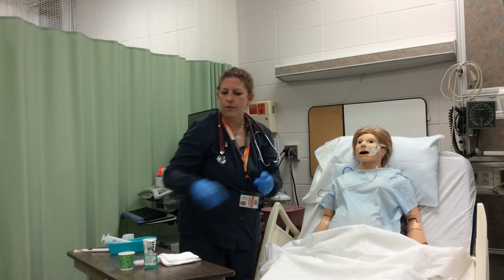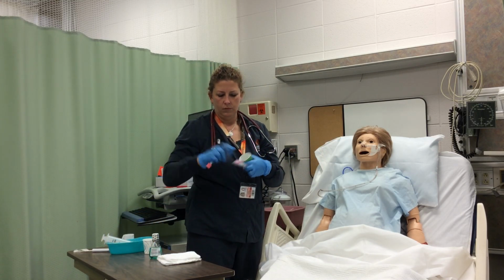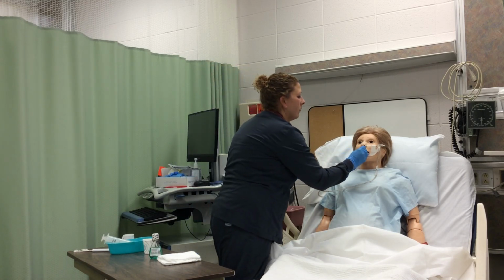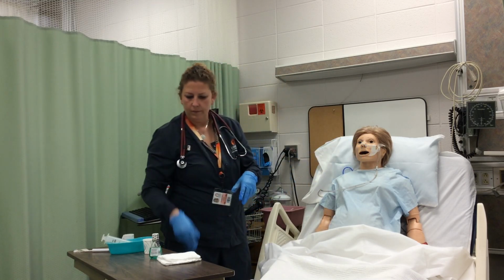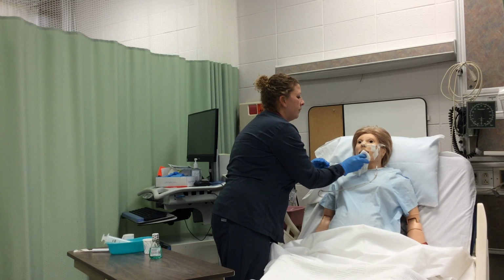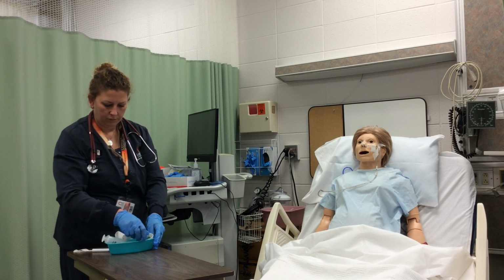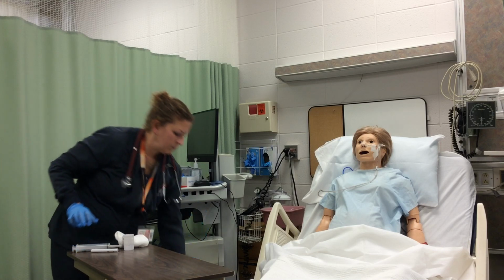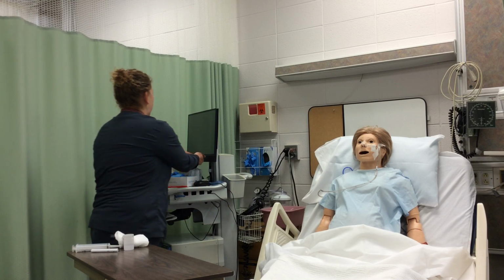I'm just going to clean out your mouth for you. Clean the tubing at the nostril with a washcloth dampened in mild soap and water. And I have a warm soapy washcloth here. Dispose of used supplies. And remove and dispose of used gloves. Perform hand hygiene.